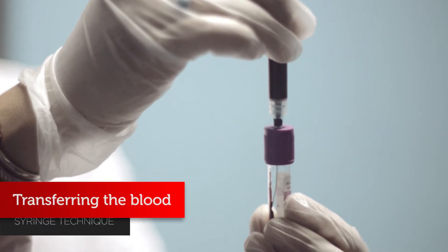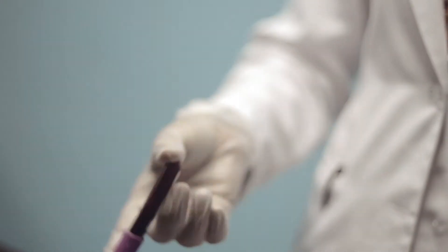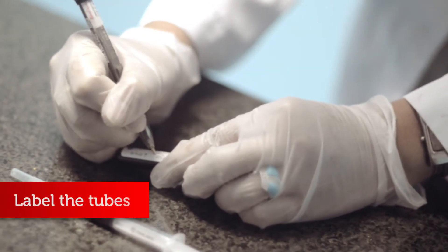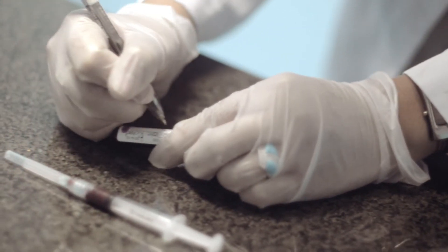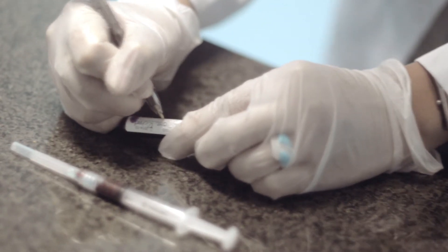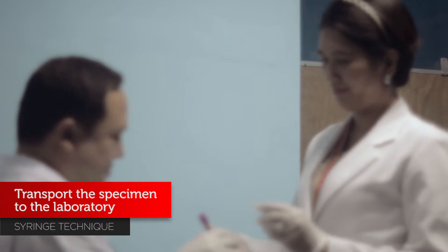Transferring the blood. Label tubes. Transport the specimen to the laboratory.